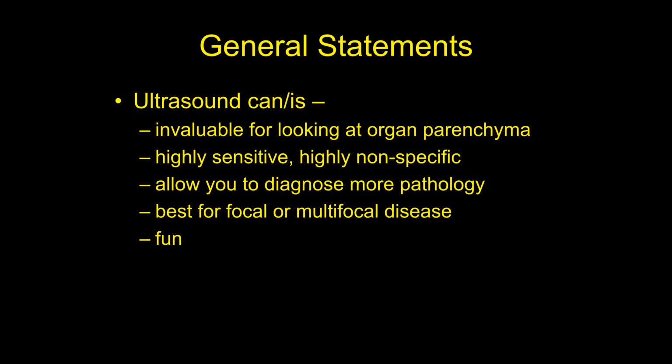On the other hand, ultrasound is like most imaging modalities, it's highly sensitive, but also highly nonspecific. So what do I mean by that? I can tell you with my ultrasound probe that there are 3 hyperechoic nodules in the liver. I can measure the diameter of those nodules. I can describe the blood flow in those nodules. So I can describe the hell out of those nodules. I can count them and do everything else, but do I know what they are? Do I know if they're benign or malignant? The answer to that is no.